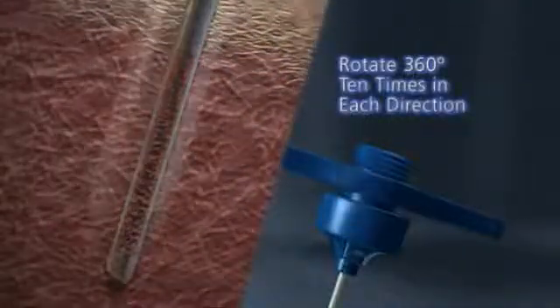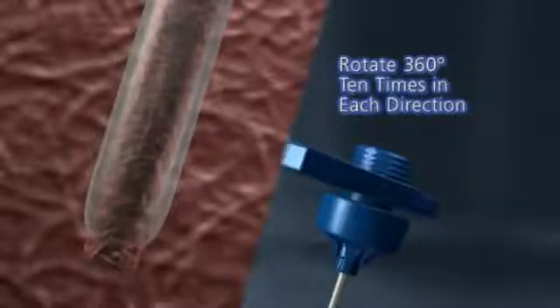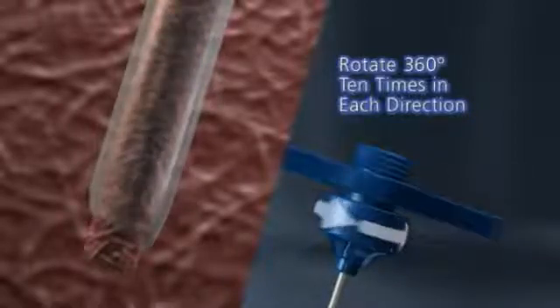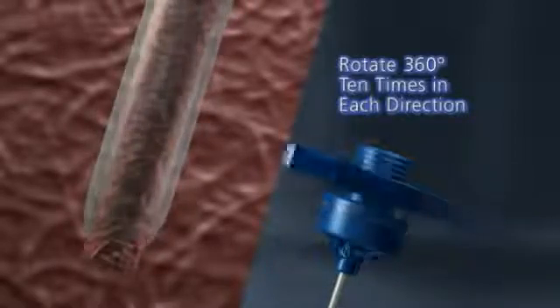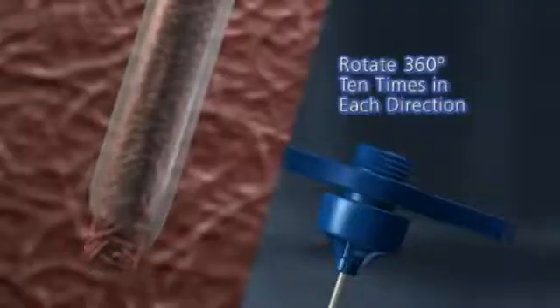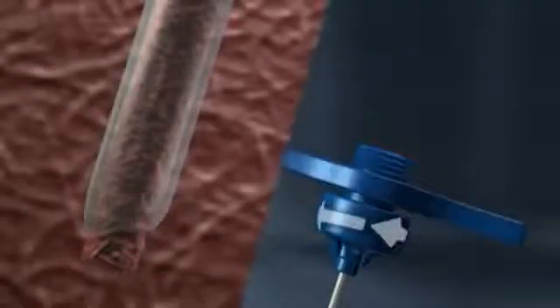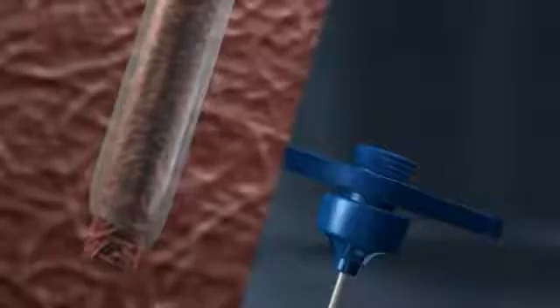rotate the needle 360 degrees ten times to the left and ten times to the right, using a quick motion and light downward pressure to allow the taper tip to help sever the specimen. Slowly remove the needle and specimen with the same clockwise-counterclockwise motion.